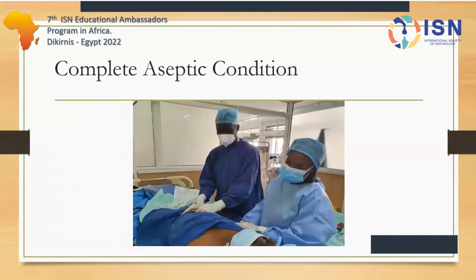This procedure should be done in a sterile environment. Everything should be aseptic. Yourself, as the operator, as well as your assistant, and all the environment basically need to be in a sterile fashion.